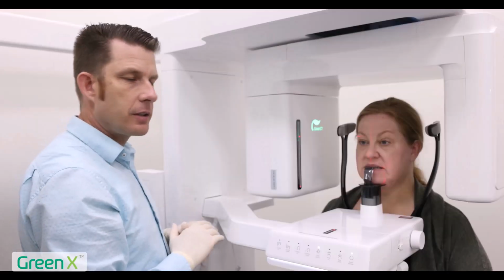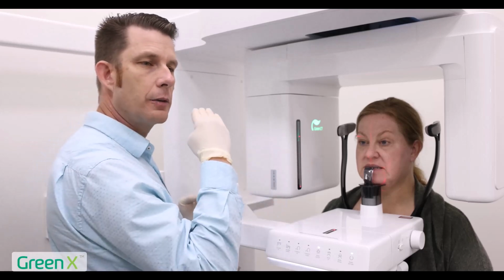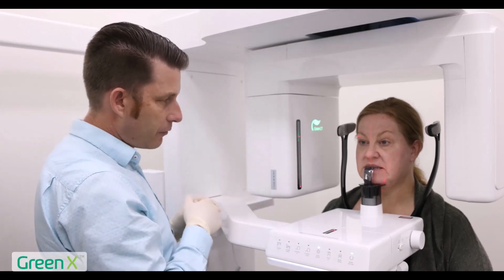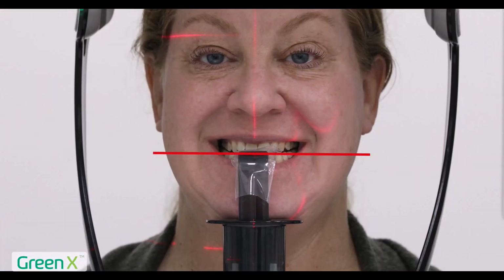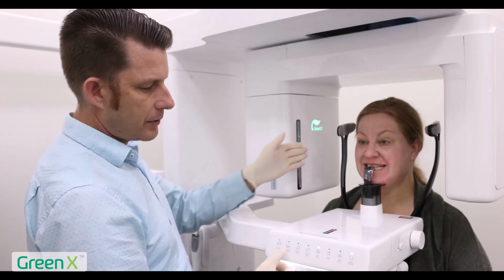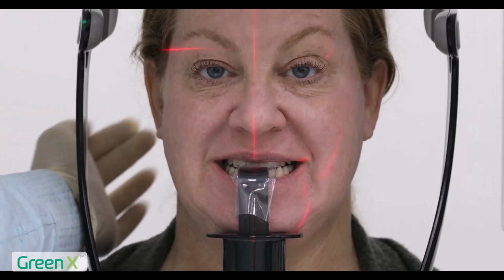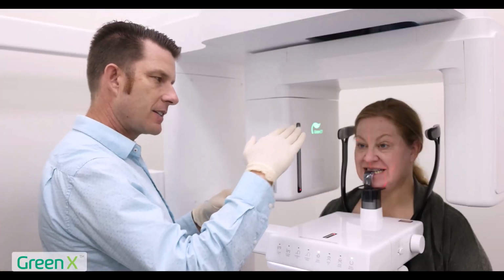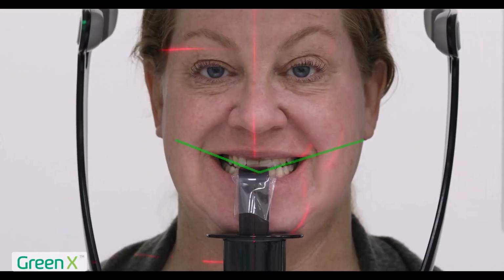Next thing I want to do is look at the patient's occlusion. I want a natural head position or the patient's occlusion tipped down 10 degrees. Go ahead and smile for me really big. To me it looks like the patient's occlusion is very flat, and I want to lower the patient's head down. I'm going to do that by the column up or down, so I'm going to lower the column, which is going to tip the patient's head down. Go ahead and smile again, and I can see my occlusion is tipped down about 10 degrees.